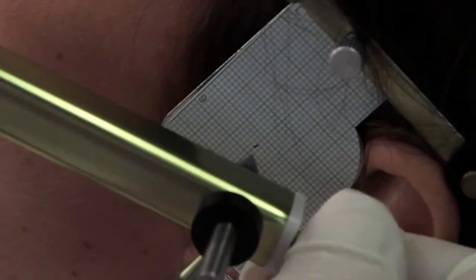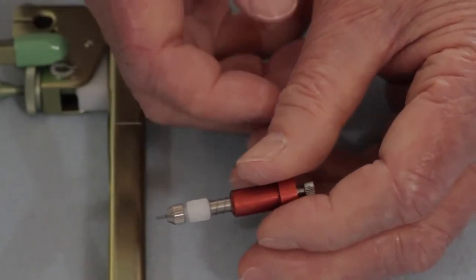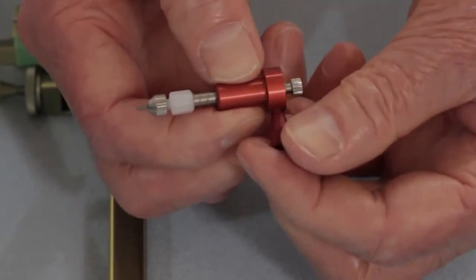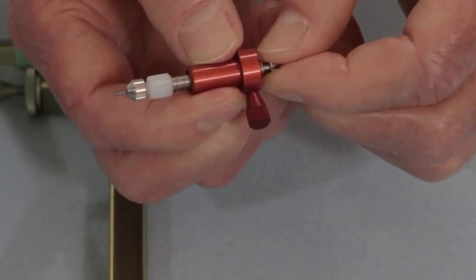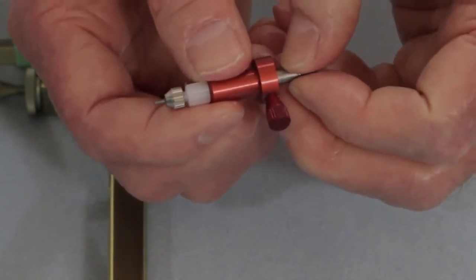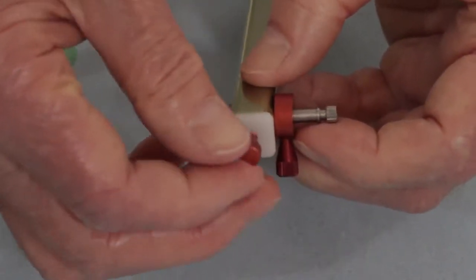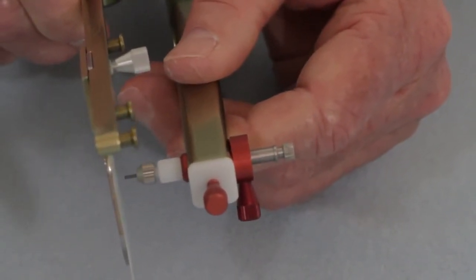Now we want to do the tracing. Now that we've established the proper distance of the sidearm from the flag assembly, we want to use the writing pencil to show you how the writing pencil works. The writing pencil is spring-loaded, and if we release, you can see it moves in and out like this. When I actually put the writing pencil into the sidearm, I want to have it pulled all the way back, and I want to lock it in this position. Then put it into the sidearm, lock it in position, and now on the patient, the writing pencil would not quite touch the flag yet.